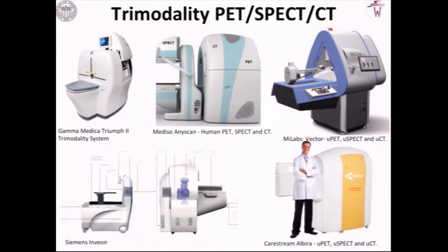As well as PET/CT or SPECT/CT, a bunch of these companies have actually made tri-modality systems, and I'm just showing them there. This one is actually a human tri-modality system, so just a combination there.